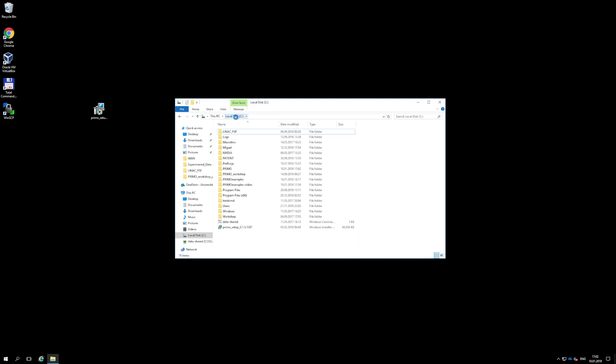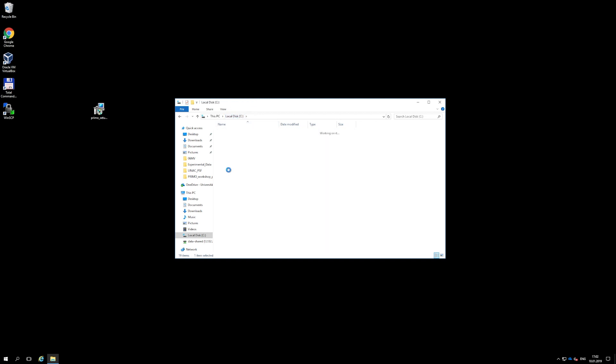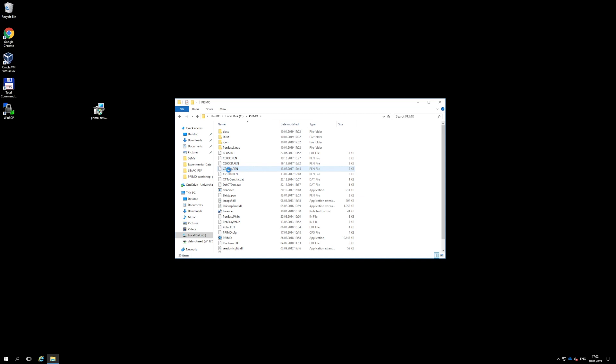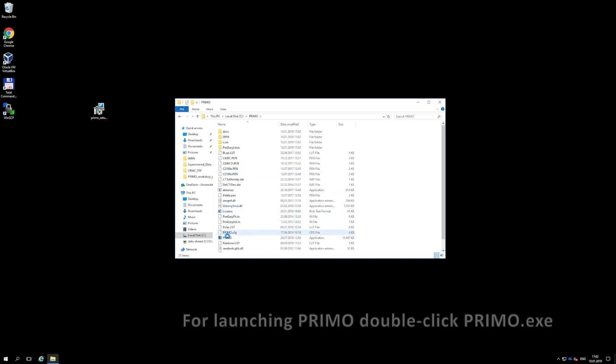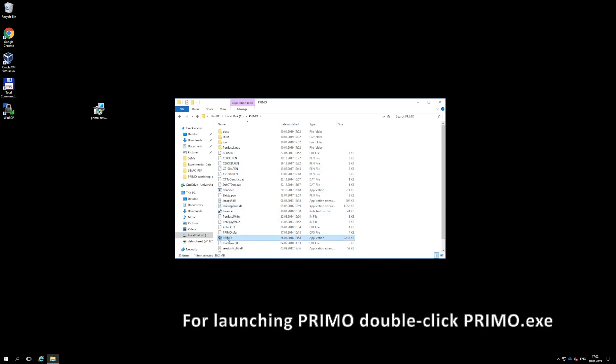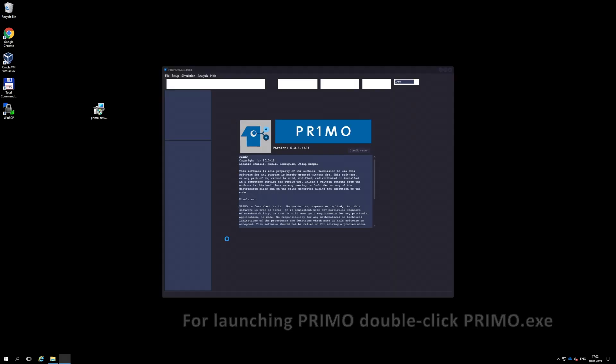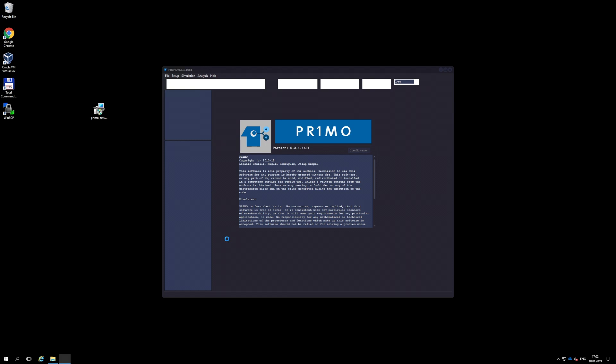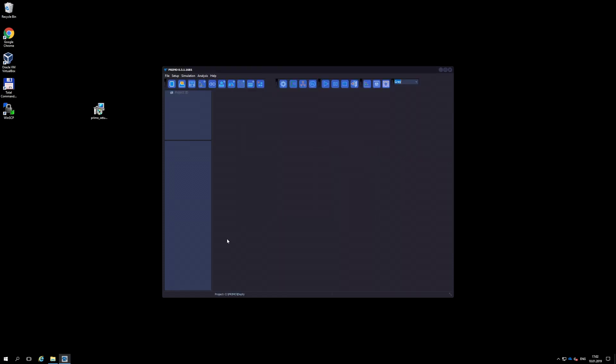To launch Primo, go to the installation directory and double-click the executable Primo file. For convenience, you can create a link to the executable file in the desktop, but the file itself, as well as any other file of the Primo directory, cannot be moved to another location.